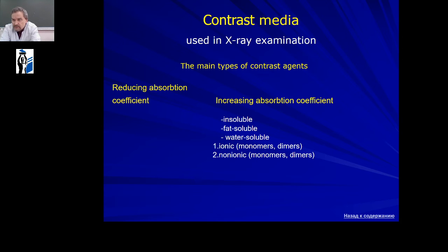Water soluble iodine containing contrast substances are used for study where blood flows, blood vessels, heart, urinary system, or urinary tract.